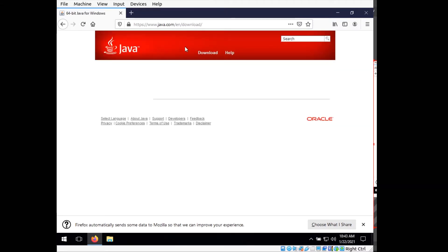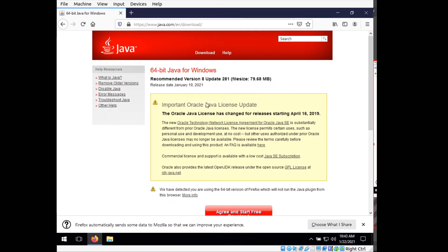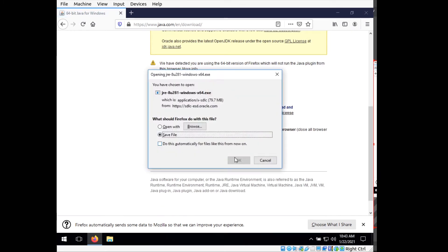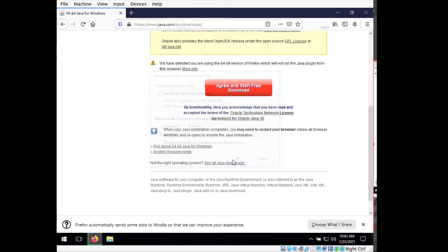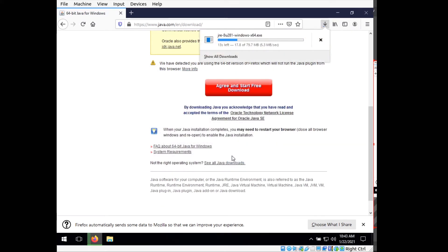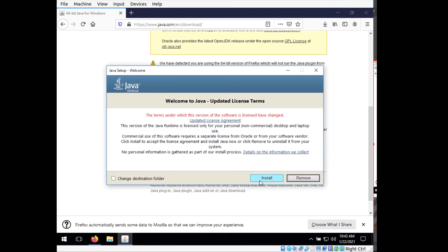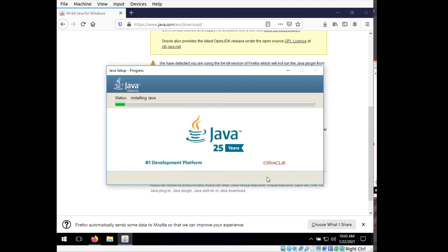So just going to Oracle's or Java's website, you want to just agree and download. Once it's downloaded, we go ahead and run it. And just do a basic install.